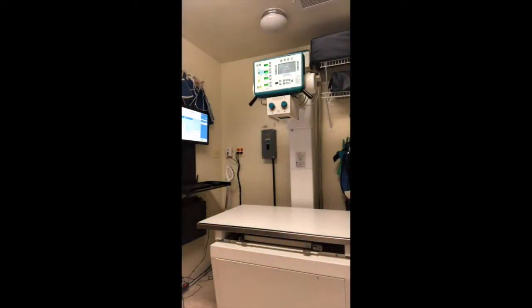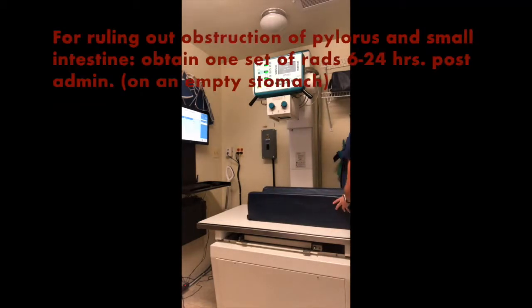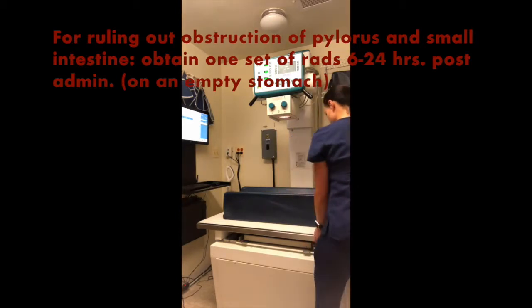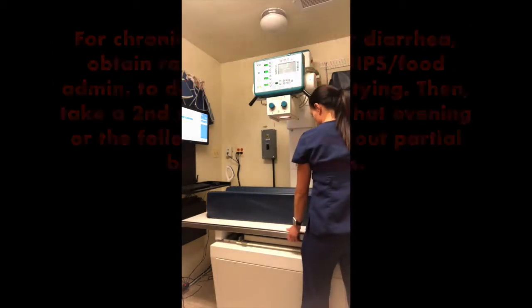Two perpendicular views, a right lateral and a VD, are typically required of the patient's entire abdomen. The time the radiographs are obtained is not critical, however, the time elapsed between the administration of the spheres and when the images are taken is important to note and should be recorded on the radiographs.